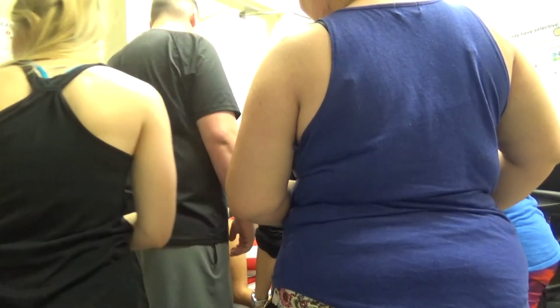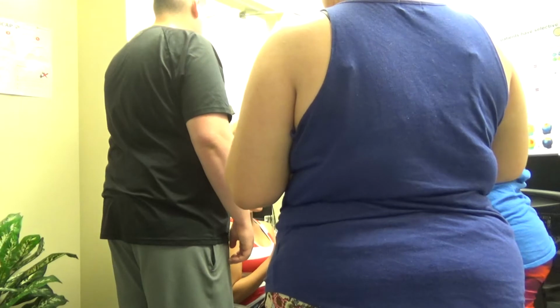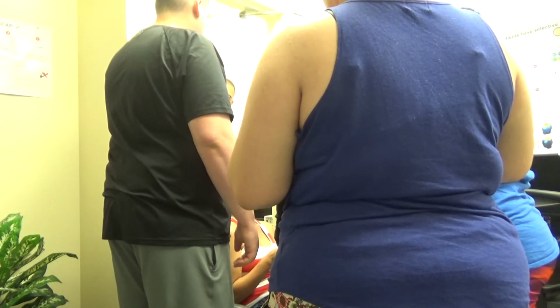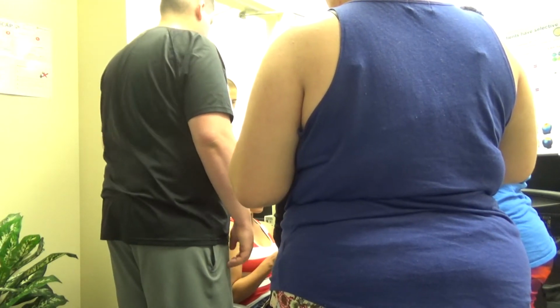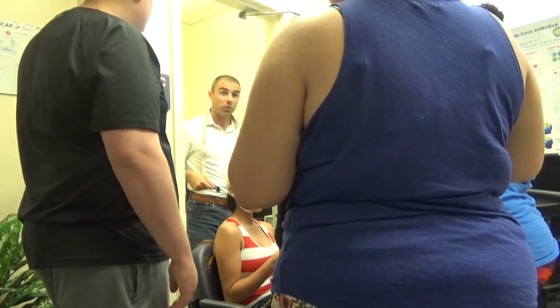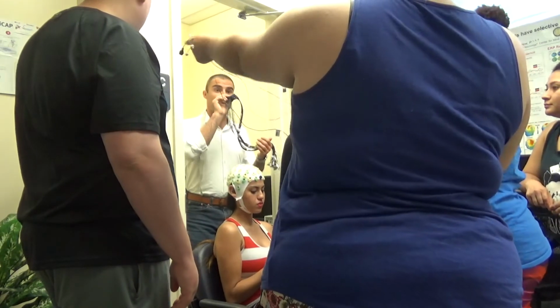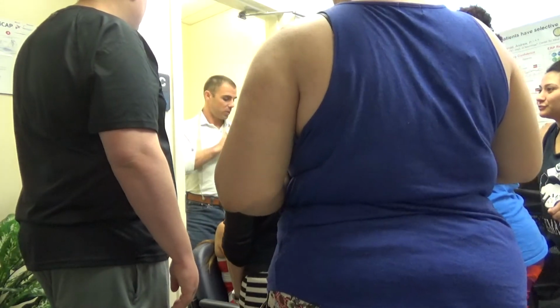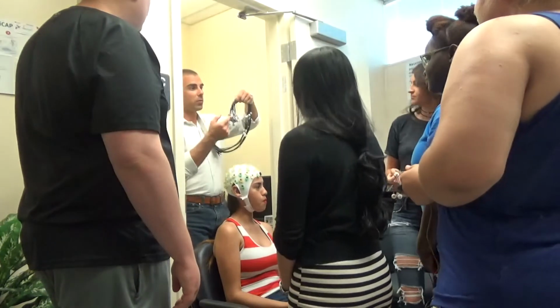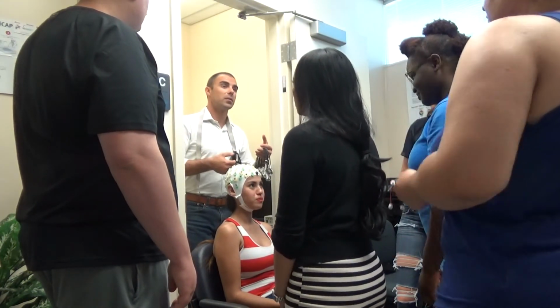Okay, so one thing to remember at this point in the game is that there are some really important elements: we need to clean the electrodes with water, but this end cannot get wet. And this side cannot get wet. This is perfectly fine to get wet. So I was gonna ask, is it like you have a little bucket and some Q-tips?